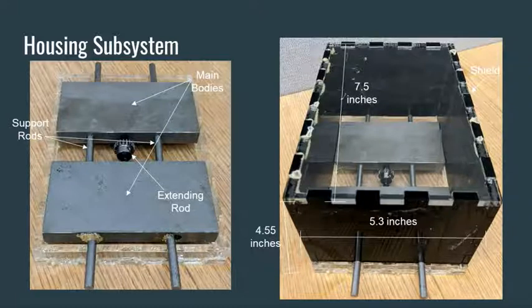The device contains tooth bands that will connect to the patient's molars and will help to expand their palate. In order to help protect the patients from potential harm, the top layers of the main body have a thin layer of acrylic to help protect the user from electric shock.